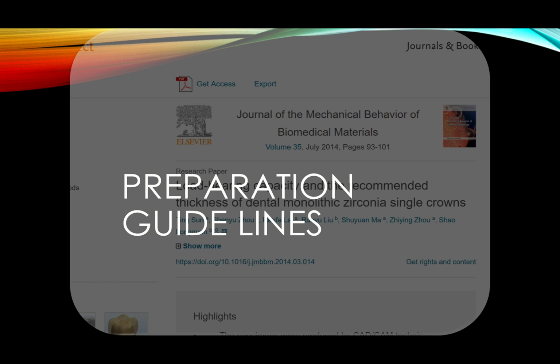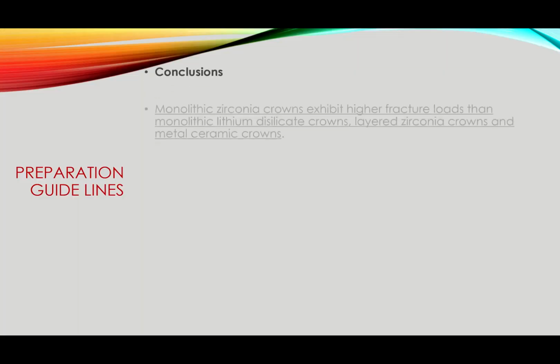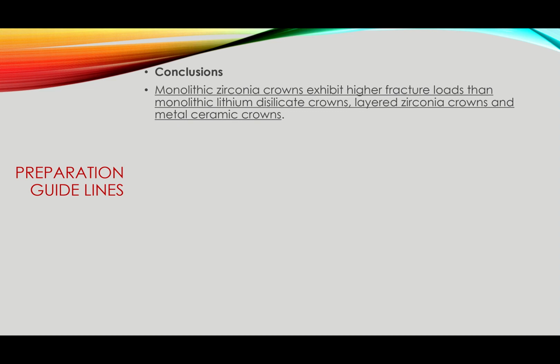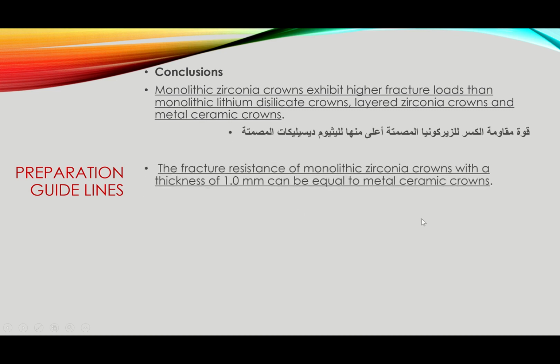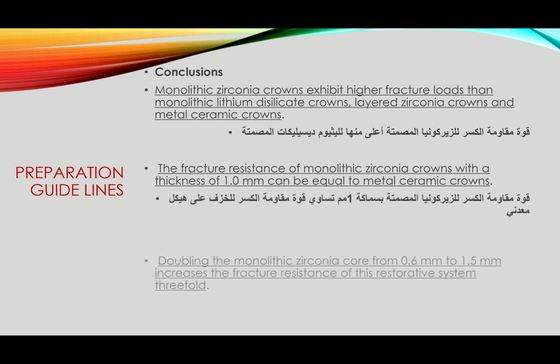Okay. Now preparation guidelines. I want to show you some conclusions. Monolithic zirconia crowns exhibit higher fracture loads than monolithic lithium disilicate crowns, of course, or layered zirconia crowns and metal ceramic crowns. So the best that you can do is a monolithic zirconia. Now, the fracture resistance of monolithic zirconia crowns with a thickness of 1 millimeter can be equal to metal ceramic crowns. Those are the conclusions of some studies that I've read and concluded for you guys.